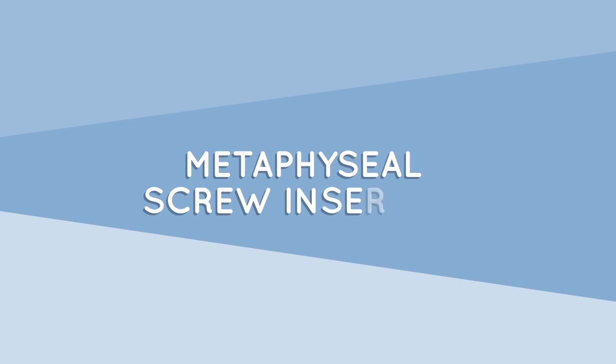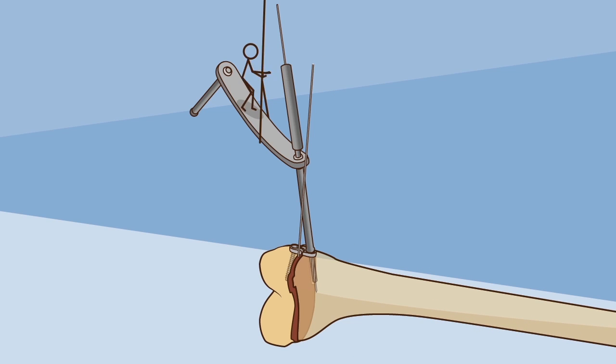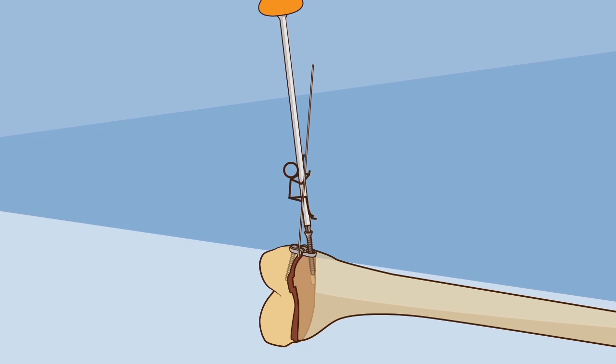Metaphyseal screw insertion: remove the guide wire and drill, then insert the second screw. Fully tighten both screws progressively.